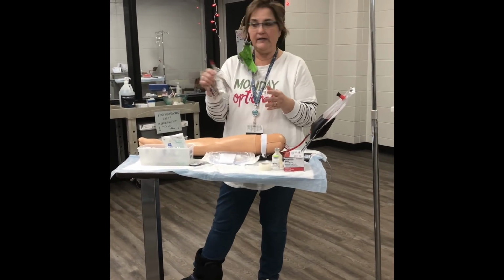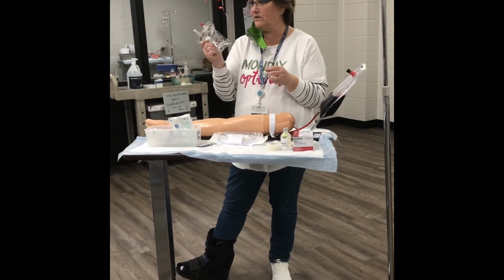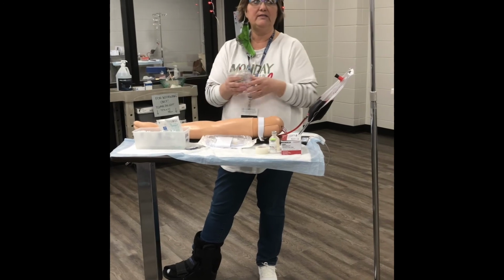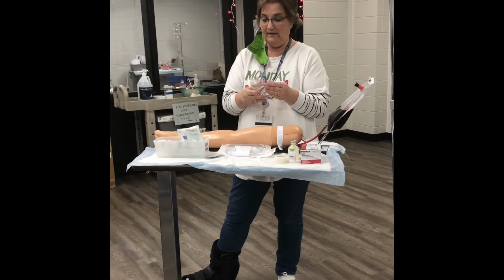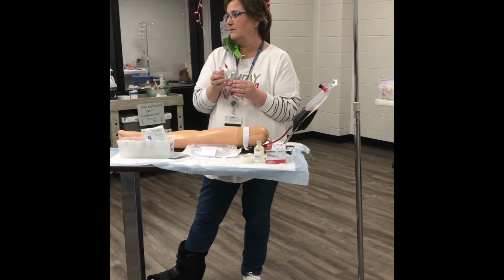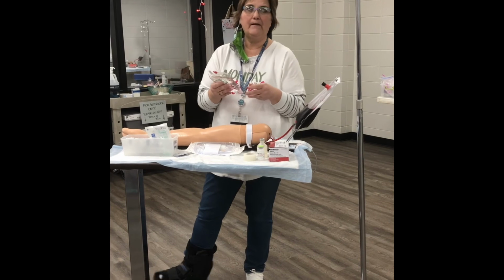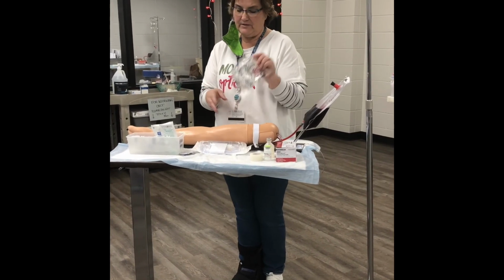Also, it should be clear. It shouldn't be pink. It shouldn't be yellow. It doesn't have anything in it, so it shouldn't be any color. The only time you'll really see fluids that are different colors is if they have meds in them. Shouldn't have anything floating in it. You're going to put that into my vein. I don't want little pieces of something in there. All right. So that's what you're going to check for on that. So we're sure that's all good.